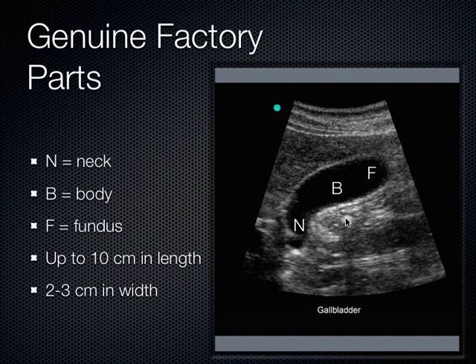And so, when you're looking directly at the gallbladder, as you get to the edge, as you're fanning through any organ, as you start to get to the organ next door, some of that sound starts to get into the organ next door to it, and it overlays that organ on top of the organ you think you're looking at. That is why some people can easily mistake it: if they get up to the edge of this gallbladder, the air in this duodenum suddenly starts to look like it's superimposing over the gallbladder, and that's how a mistake can be made, and you can say, oh, there's a gallstone, when in reality it was just some air in the duodenum.